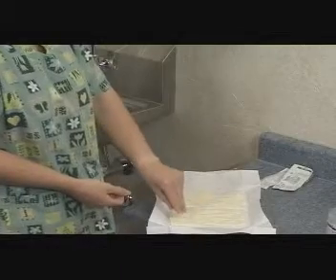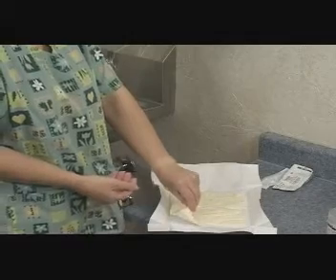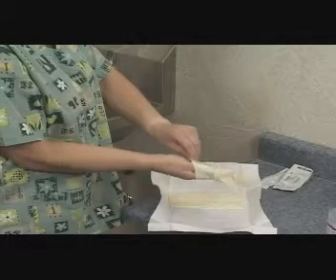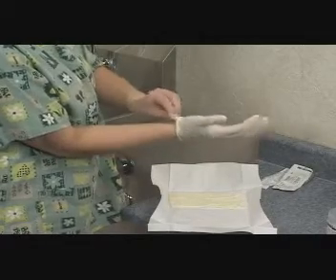Identifying the right and left glove, she prepares to glove her dominant hand first. She grasps the glove by the cuff with a thumb and the first 2 fingers of her non-dominant hand, touching only the inside of the glove and keeping her thumb against her palm. She inserts her dominant hand into the glove. She pulls the glove on gently.